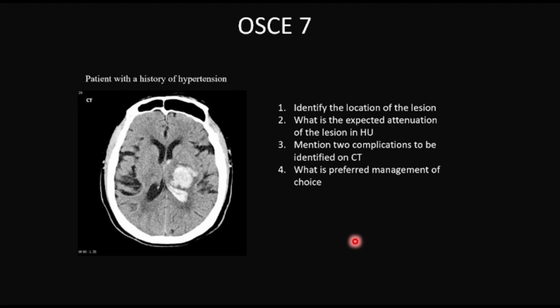So identify the location of the lesion. What is the expected attenuation of the lesion in Hounsfield units? Mention 2 complications to be identified on CT. What is the preferred management of choice?